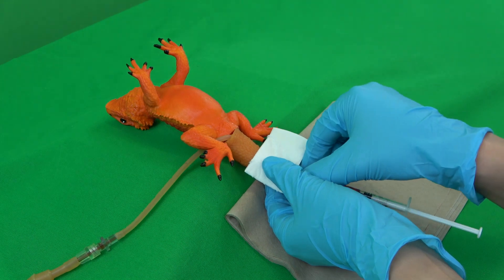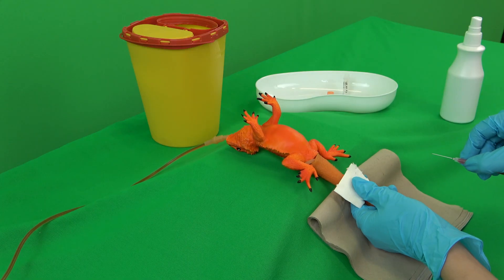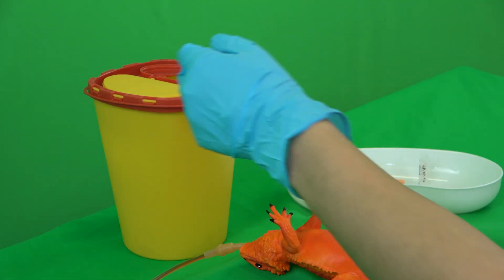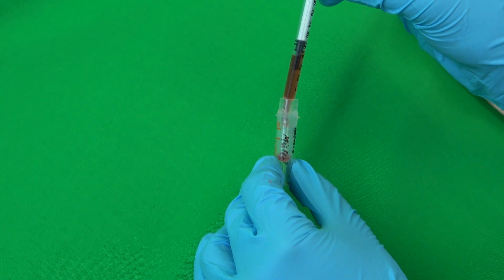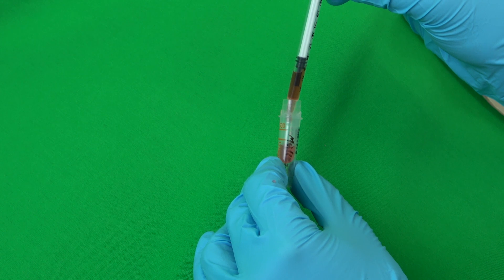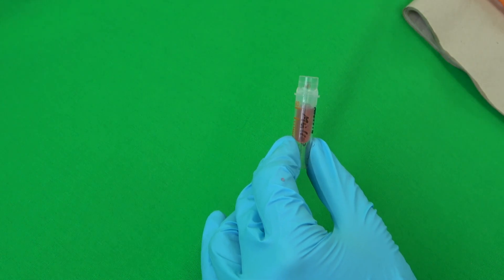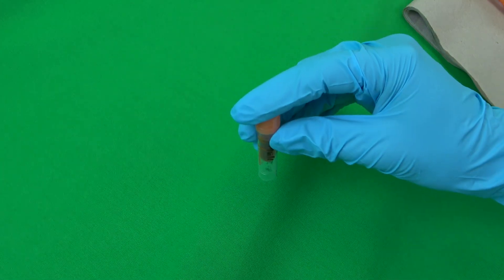Lastly, a gauze swab is pressed onto the puncture site while the syringe and cannula are removed. The cannula is subsequently properly disposed of. To prevent coagulation of the blood, the sample must swiftly be transferred into the lithium heparin vial. The blood is injected while keeping constant contact with the vial wall. The lid is closed and the vial carefully swayed back and forth. The syringe is then disposed of.